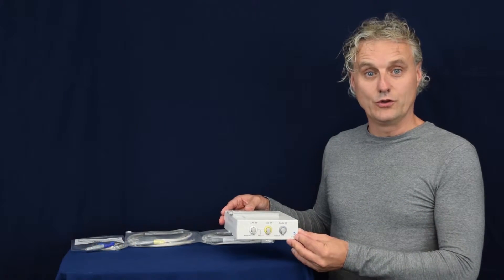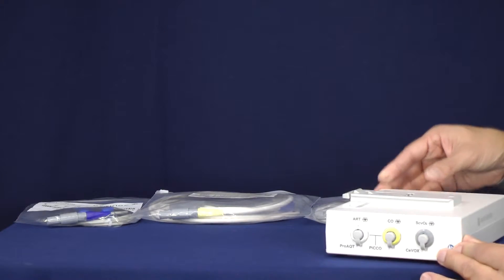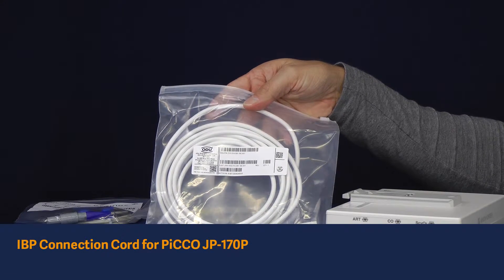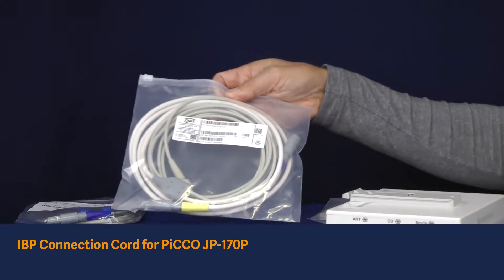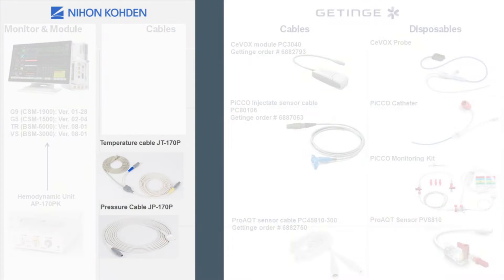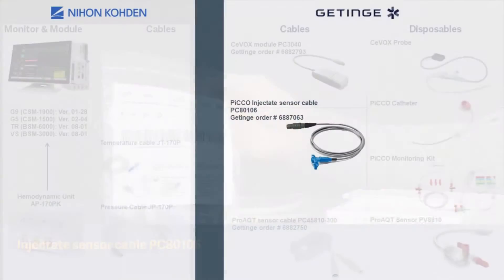In order to use the unit you need the following cables. The first cable you need is the IBP connection cord. The other cable is the cardiac output connection cord. Both cables will be provided by Nihon Kohden. You also need the PiCCO injectate sensor cable.